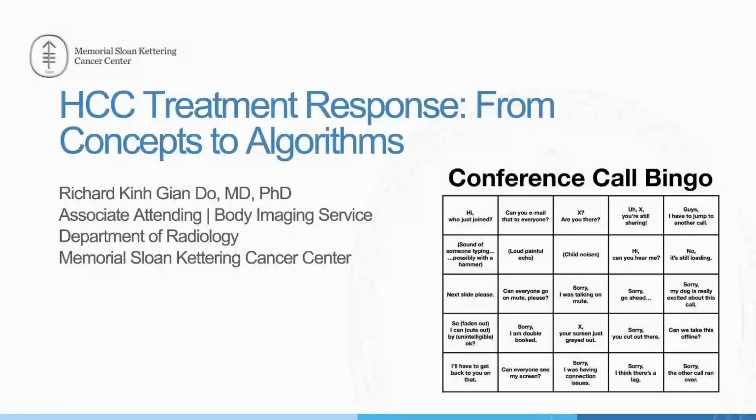So, as advertised, I'll talk about treatment response, and I'll talk more about the concepts behind treatment response and how that guided the response working group to develop the LI-RADS treatment response algorithm. Tomorrow, Dr. Mandarita Lala will talk more about case examples and applications to local regional therapies. But today, let's talk about the concepts behind it. A few disclosures.